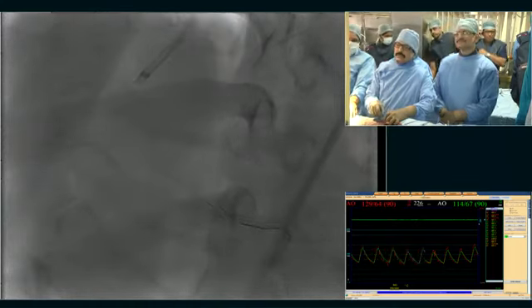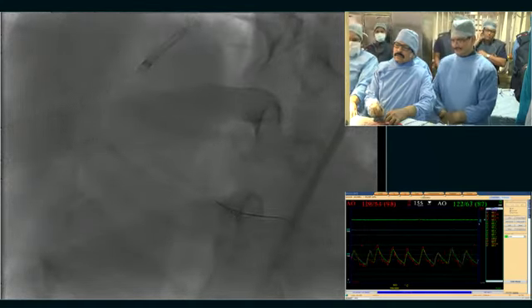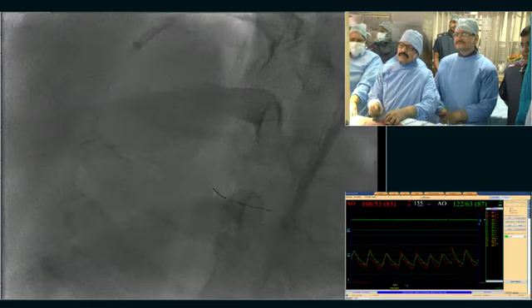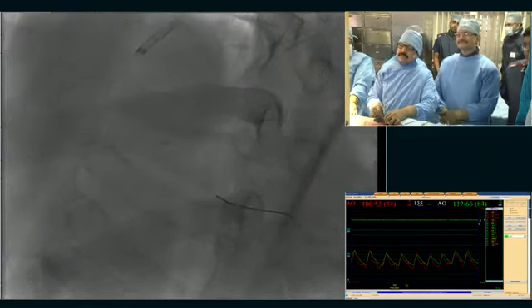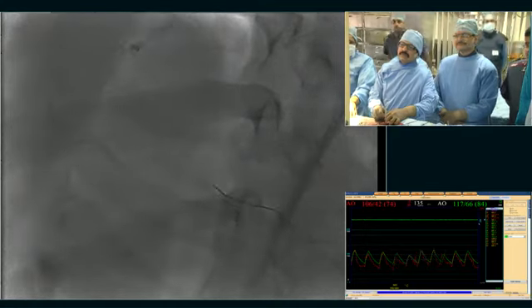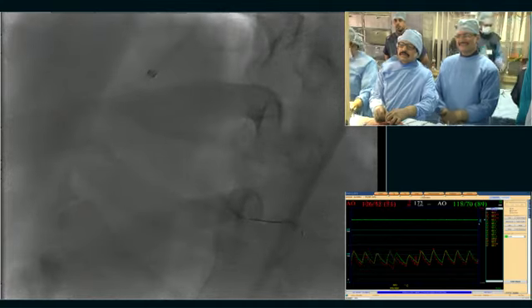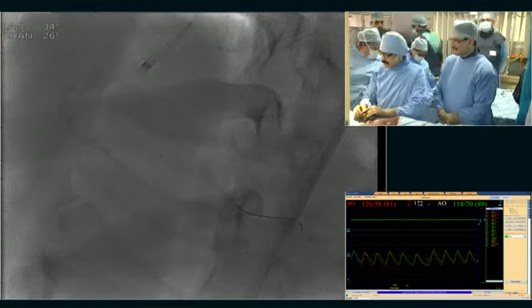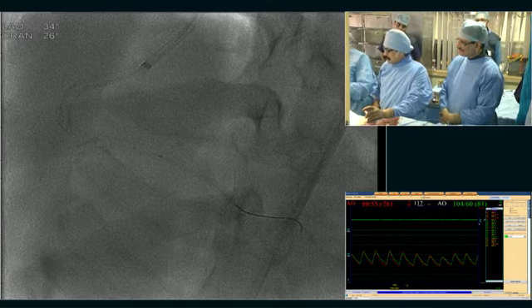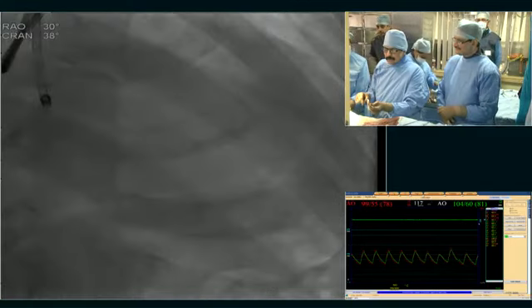So what will be your choice for the wire to cross? Sion. Sion, I would. Pancos Pro, maybe, for the PLV? Why a stiff wire for crossing a side branch? Nobody needs a stiff wire for that. Intermediate wire. Okay, take the wire. Do you think he will succeed to cross? Hopefully we will do that. Who thinks he will succeed? A few. So you are not optimistic?